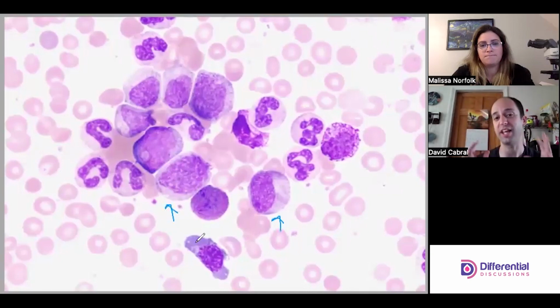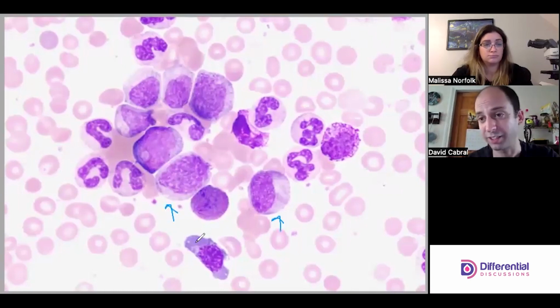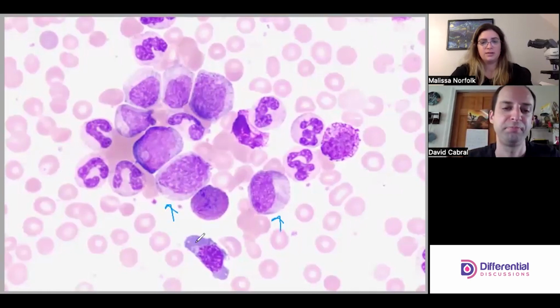So every now and then, and it's usually in body fluids that I've seen it best, you learn all this stuff about mitosis, but you can see it practically in the scope sometimes. It's pretty wild. Yeah. And you can see that it's clumpy, but separating from itself, kind of. Yep, really cool.